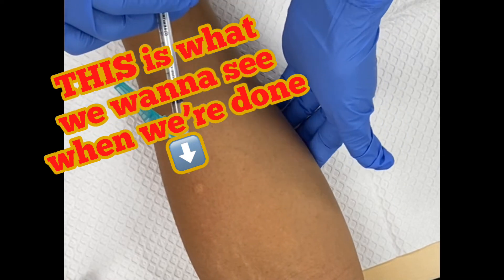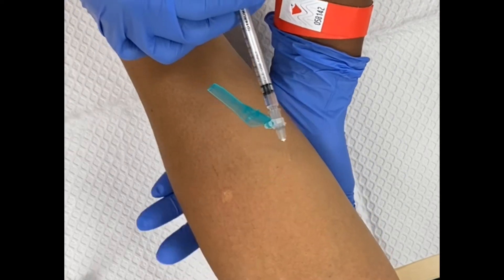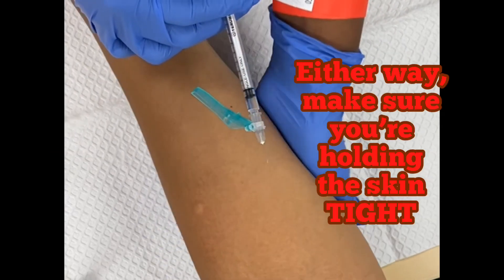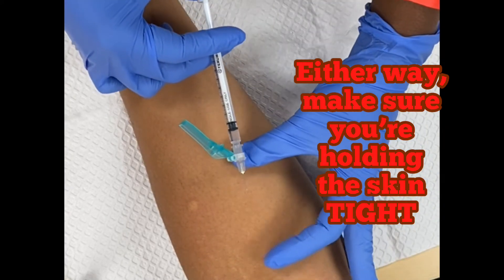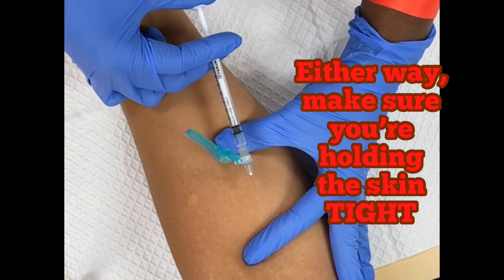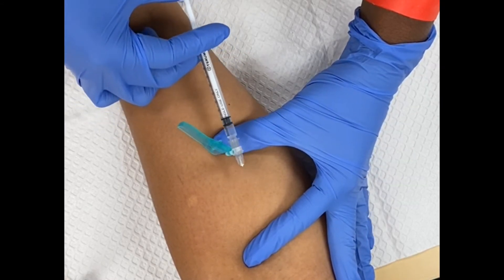There are two ways you can taut the skin, because you have to taut the skin to smooth it out. You can either taut this way or this way — I just happen to be more comfortable tauting it this way. We're going to taut her skin, and remember: 15-degree angle, you're almost laying flat on your patient's skin.